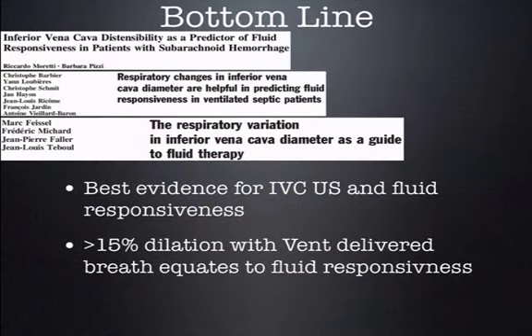Turns out the best evidence available for IVC ultrasound is actually in the mechanically ventilated patient when it comes to fluid responsiveness. And here are the three main studies that are most widely cited. Each of them are very small studies. Each of them have multiple problems with the way that they measured the IVC, and all of them had patients who were completely synchronous with the mechanical ventilator. In other words, they were deeply sedated or paralyzed and they were not breathing over the vent.